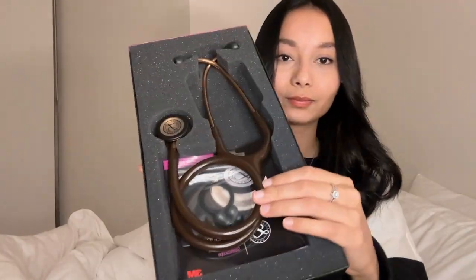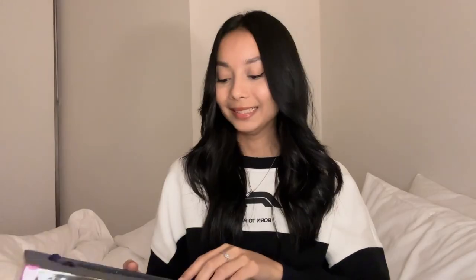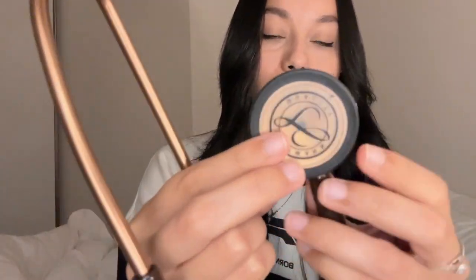I'm just going to open it — I have already opened this and seen it because I had to check that the stethoscope was all good before purchasing it. Here it is! It's a chocolate brown stethoscope with a bronze copper finishing. It's so pretty — I love the finishing.